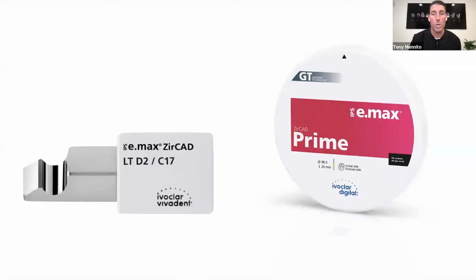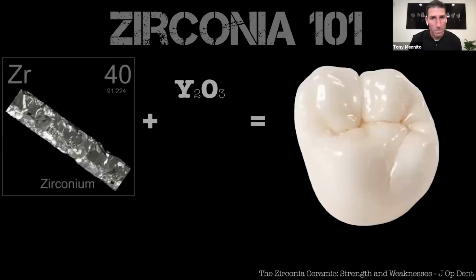And then I got to talk about zirconia. So I'm running a little behind here, so I'm going to try to catch up. But zirconia is a really hot material, obviously. If you don't know much about zirconia, people call it zirconium. Sometimes zirconium is actually a metal. They mix that metal with something called yttrium oxide to create a ceramic, which is zirconia, ends in an A.